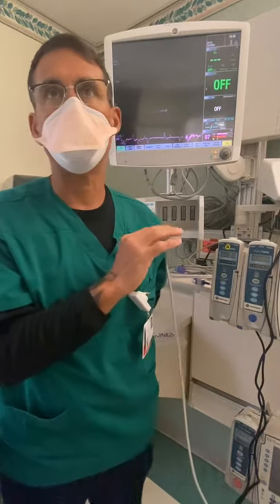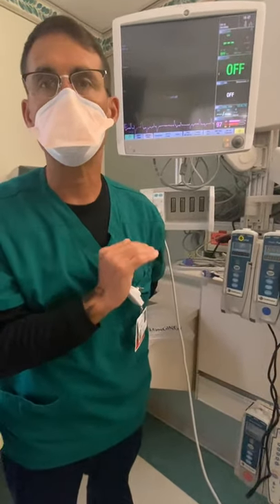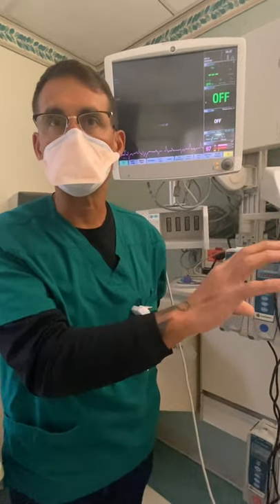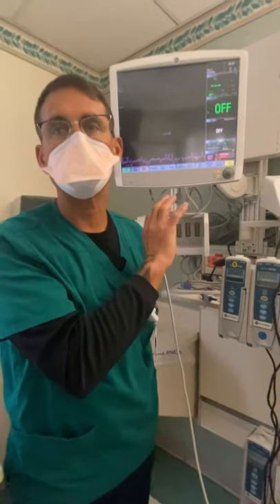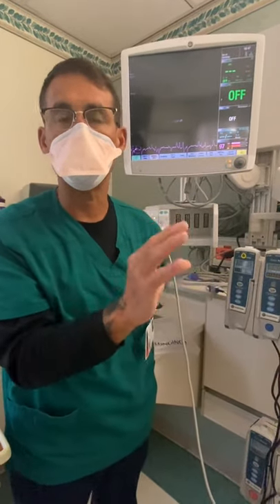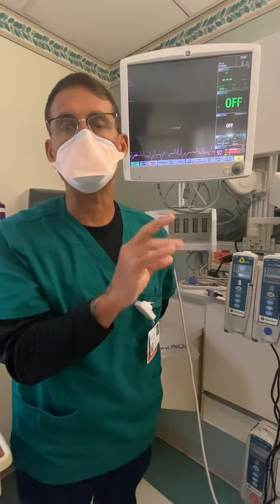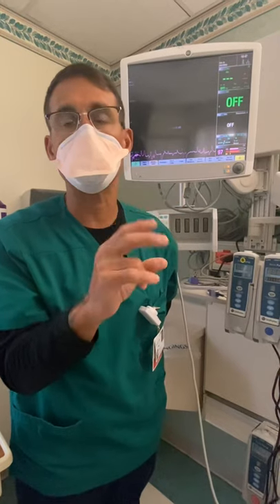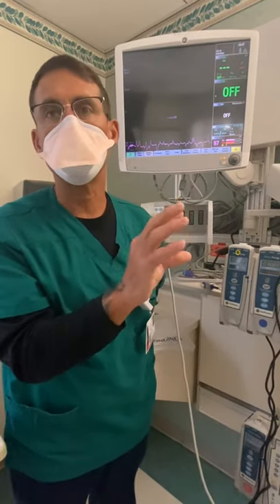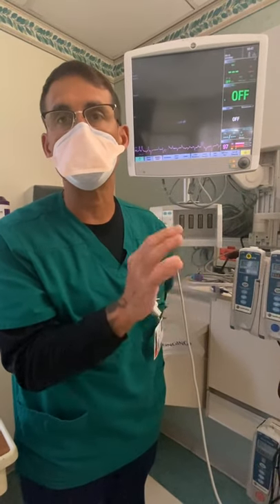One more thing that people have asked: this does not take away the need for train of four. Train of four is to assess the level of paralytics on a patient. This is to assess the level of sedation on a patient. So you're still going to do your train of four. However, the reason you do train of four is not necessarily to assess how paralyzed the patient is. Yes, it tells you that a little bit, but the reason is so that we don't give too much paralytic to a patient and cause nerve damage.